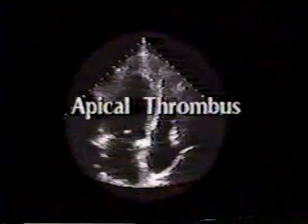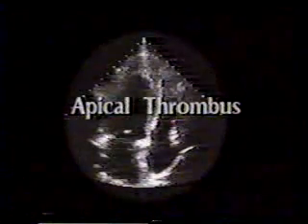This 2D study is from a patient with an acute anteroseptal apical infarction. The apex is packed with thrombus. In apical long axis format, the extent of the infarct and the apical dyskinesis are more apparent. In apical two-chamber format, you can see the marked dyskinesis of the anterior wall. With all this rocking, you can see why there would be a tendency for this thrombus to embolize.